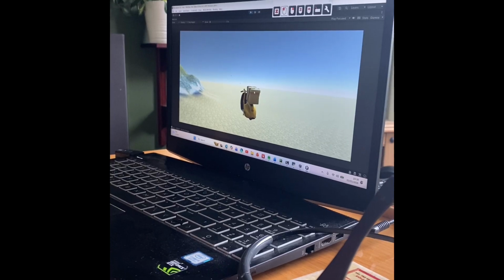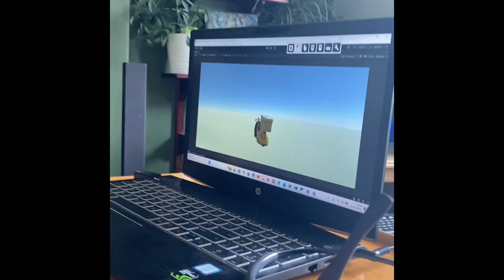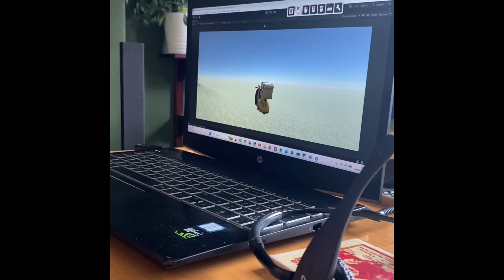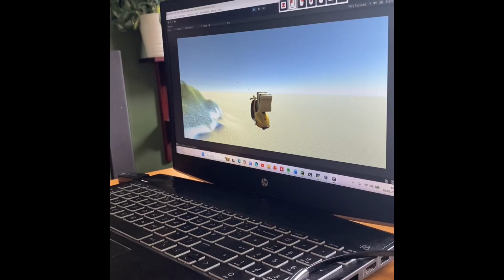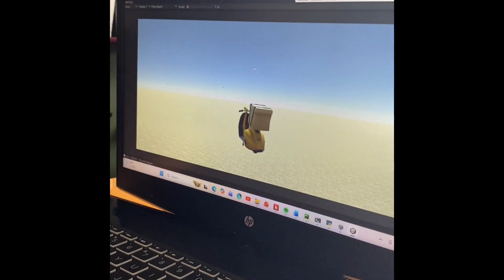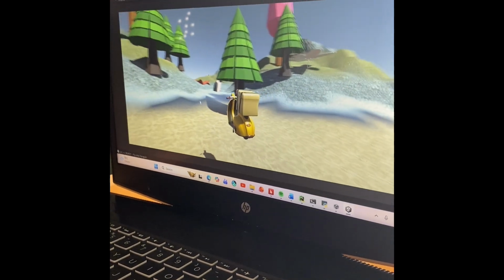So if I stay central with my head, then there's no movement. If I want to move forwards, I go to the bottom of the screen with my mouse, basically tilting my head forward. If I want to move backwards, I move to the top of the screen, and that allows me to reverse. If I go left, it goes left. If I turn to the right, it goes right. Now that's pretty intuitive in terms of forward, backwards and sideways movement, but the question remains, how would a quadriplegic do upwards and downwards movements?